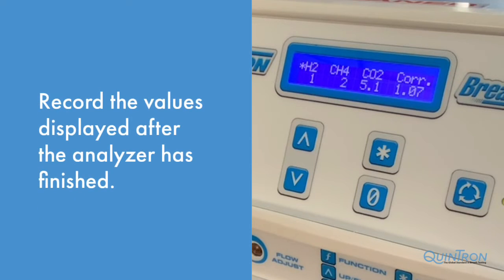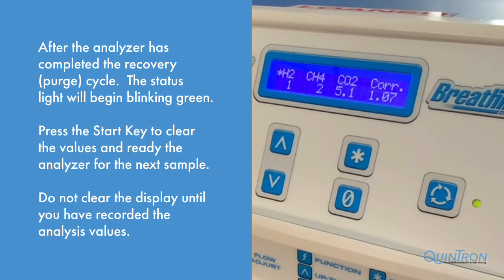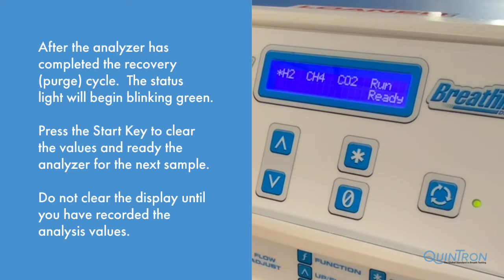Record the values displayed for the patient sample after the analyzer has finished. After the status light begins blinking green, the machine is ready for the next sample. Press the start key to clear the previous patient sample and ready the device for the next. Do not clear the display until you have recorded the values, as they are not able to be recovered after the start button has been pressed.